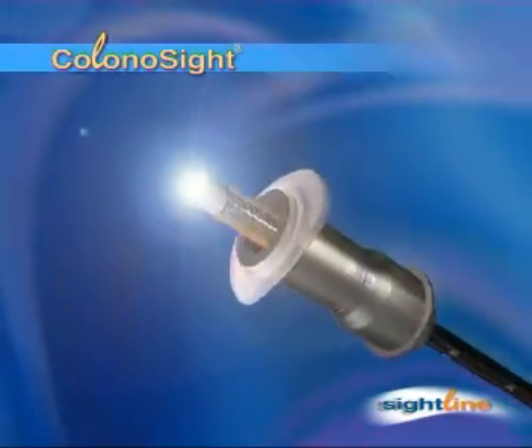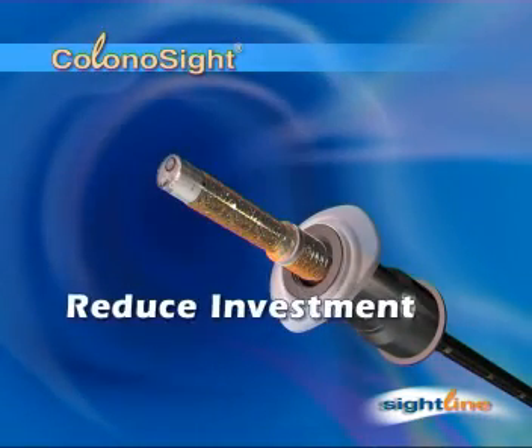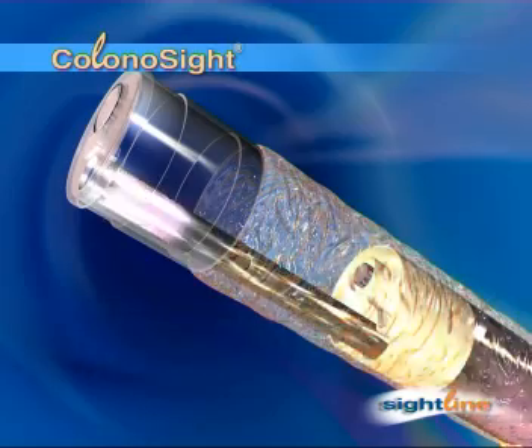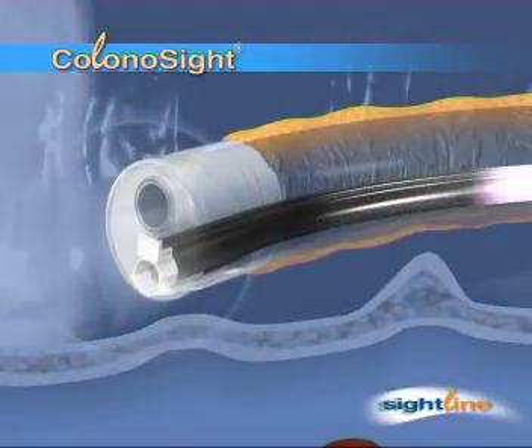With Colonosight, there's no need to disinfect, so only one scope is required and initial capital expenses are low. Colonosight's unique disposable sleeve covers the length of the tube while it's inside the colon. All the working channels within the tube are also disposable.